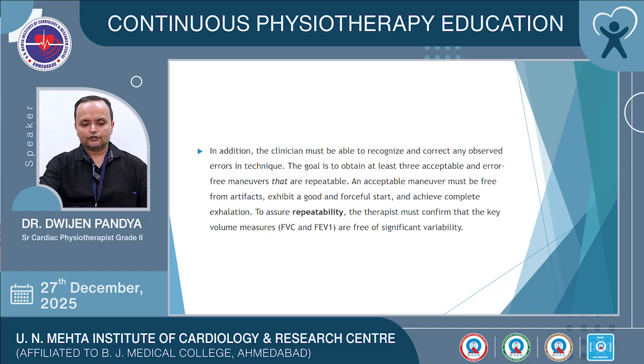In addition, the clinician must be able to recognize and correct any observed errors in the technique. The goal or the target is to obtain at least 3 acceptable and error-free maneuvers that are repeatable. An acceptable maneuver must be free from artifacts, exhibit a good and forceful start, and achieve complete exhalation. To ensure repeatability, the therapist must confirm that the key volume measures, that is the FVC and FEV1, are free of significant variability.